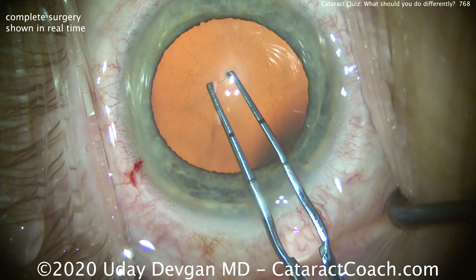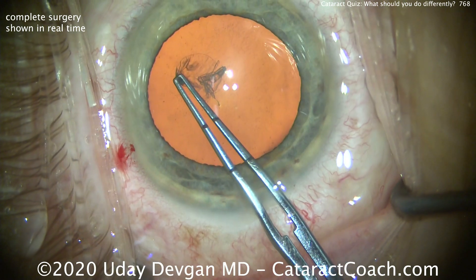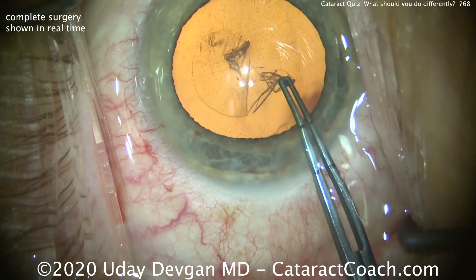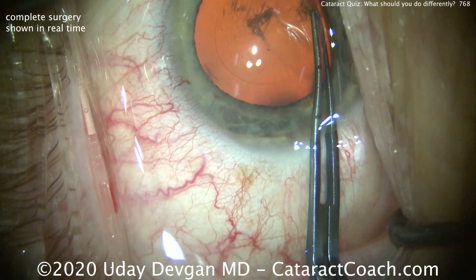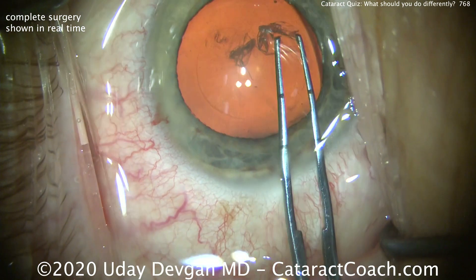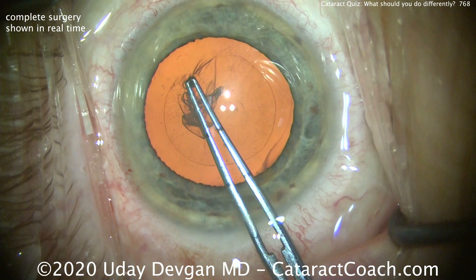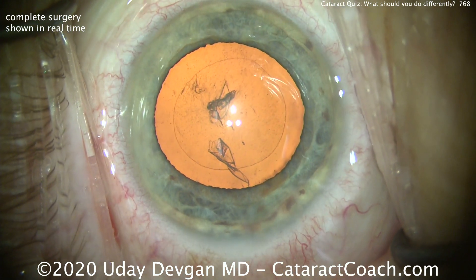We've got good coating of the endothelium, a good fill of the anterior chamber, and here comes the capsulorhexis. This patient's just going to have cataract surgery alone. The patient has a pachymetry of about 590 microns and a reasonable endothelial cell count. This patient's also quite elderly, and we're not anticipating a corneal endothelial transplant in the next five to eight years. The rhexis looks great — five millimeters measured.